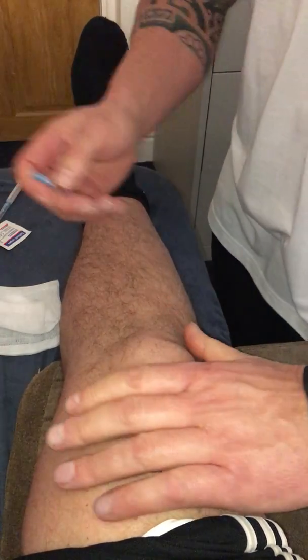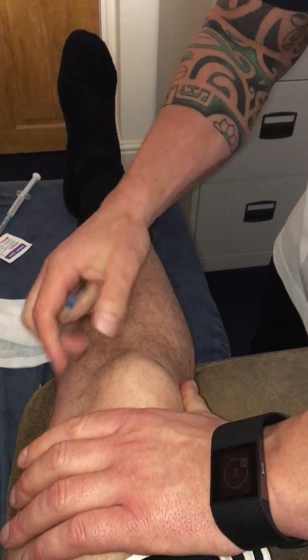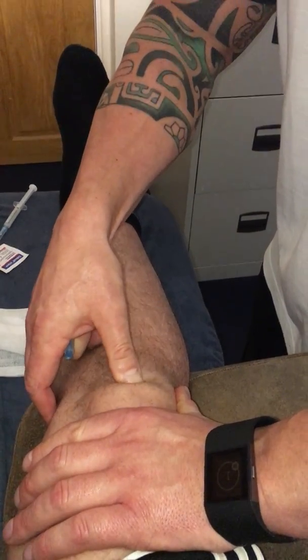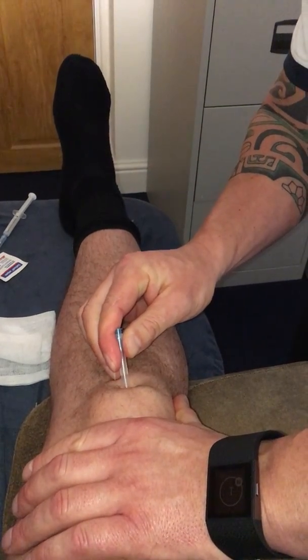Put my hand on the kneecap, top of the pole of the patella, just tilt the patella and palpate. Any pain there? Yes. Mark the center part of the pain area.